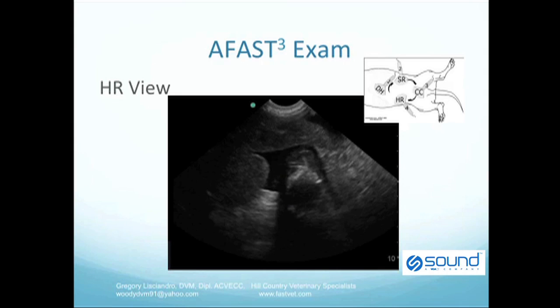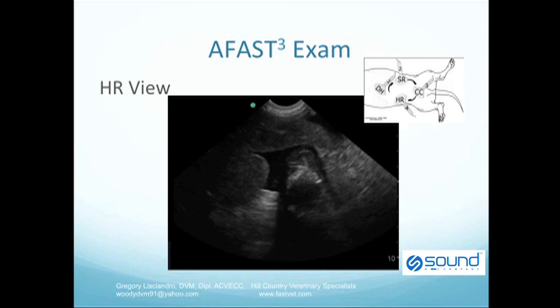On the HR view shown here, there is obvious free abdominal fluid recognized by black triangles or anechoic triangles with sharp angles right in the middle of this image. Such angles are not representative of any normal intra-abdominal structures. The HR view is nicknamed the home run view because it finishes the AFAST exam and is an appropriate site to perform abdominocentesis. It should be noted that ultrasound cannot characterize fluid, which can only be accomplished by abdominocentesis with fluid analysis and cytology.